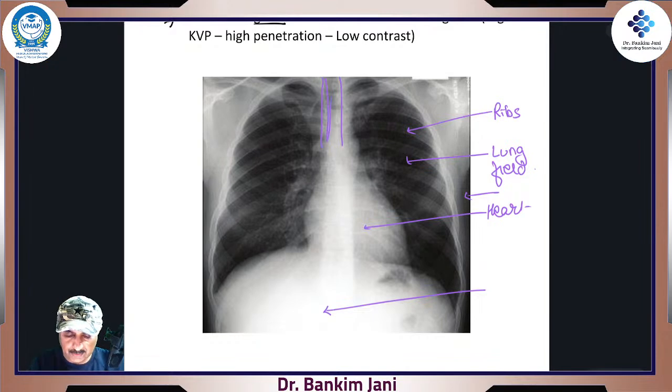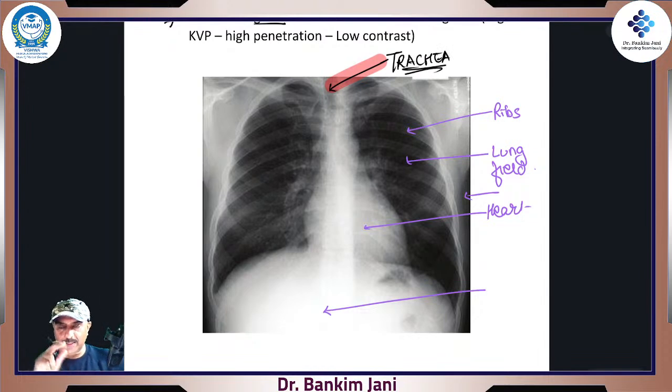Watch for this portion, this one. This is the trachea, right? See this shadow? So that's the trachea. This trachea is telling us something. Now you know what the mediastinum is, right? Trachea is part of the mediastinum.